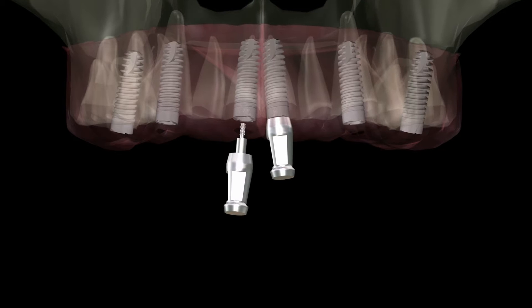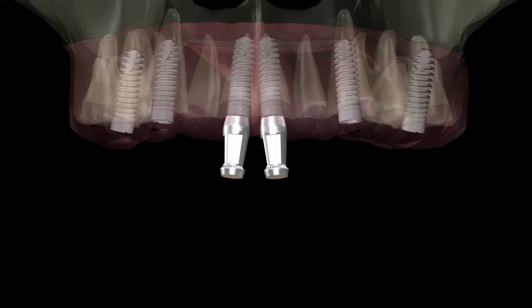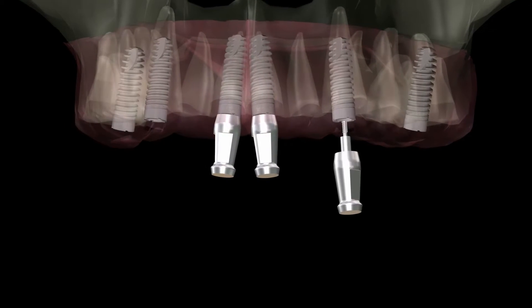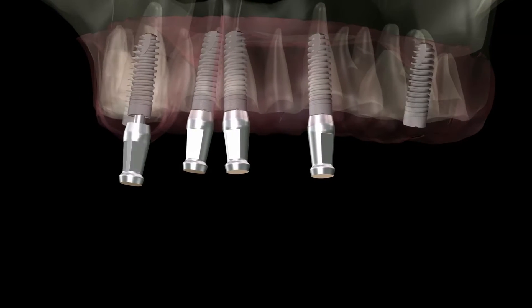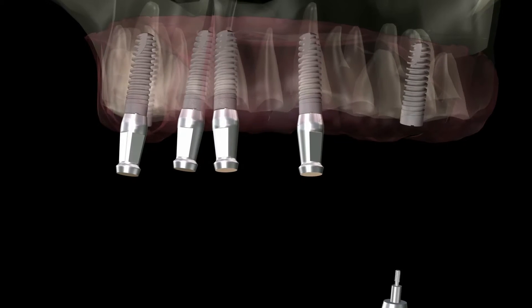With a specifically designed implant coping, the practitioner can simply make the impression and direct the laboratory to angle correct all intended abutments for next appointment delivery. To begin the process, screw the specifically designed one-piece non-engaging impression coping into each implant.